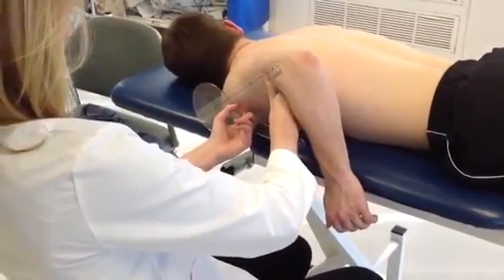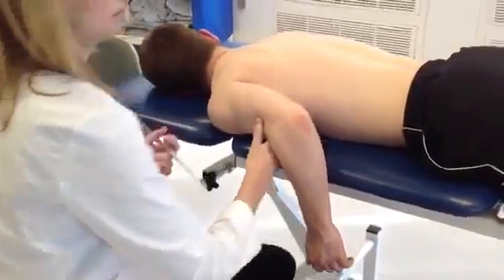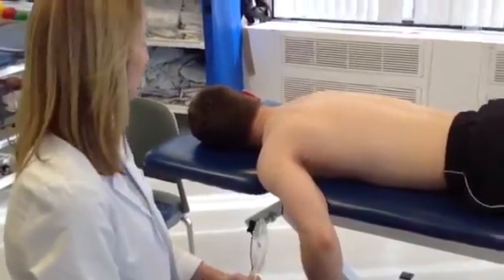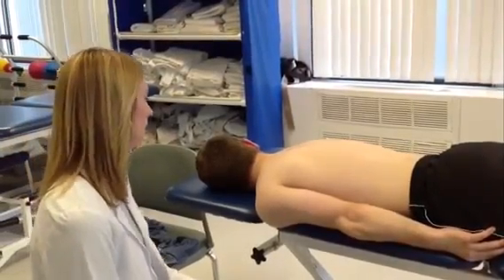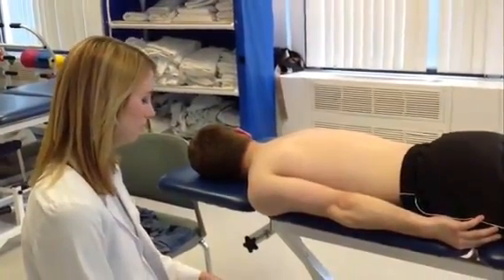So there I get 40 degrees of motion, which is just about equal to the active range of motion of 38. Okay, so this time I'm going to move on to looking at your glenohumeral extension.